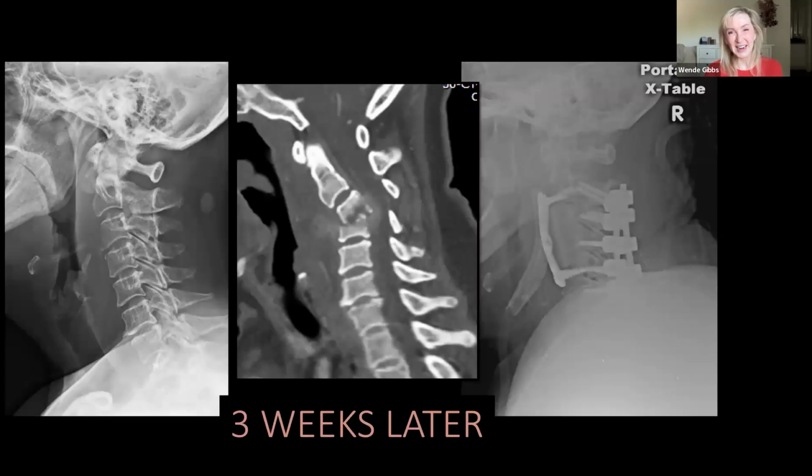So this just shows again kind of how fast this progressed. And this is what I try to emphasize to our trainees: you really need to be on top of this because it can go so fast. And who knows what would have happened to this woman if she hadn't come in. And maybe you all know. Dr. Galfano knows. But so they went ahead, the residents did their work here. They took out that infected bone, put in this big corpectomy and front and back fixation.